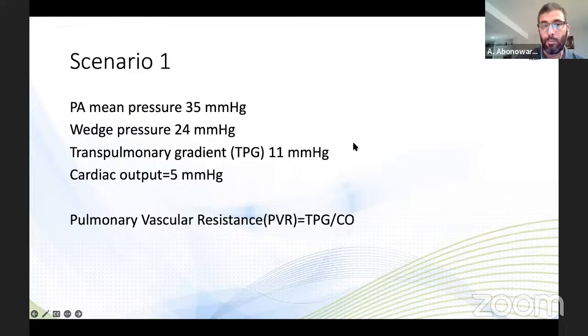If you have low ejection fraction or low blood pressure, the patient is hypotensive, or the patient is hypoxic with pneumonia, the measurements are sometimes not that accurate. Measurements have to be taken where everything is in line to be accurate. If you can comment on that, Dr. Sam Haley, just briefly.